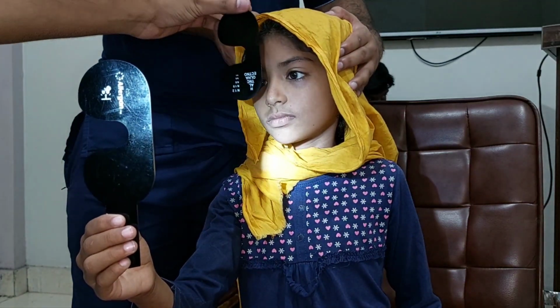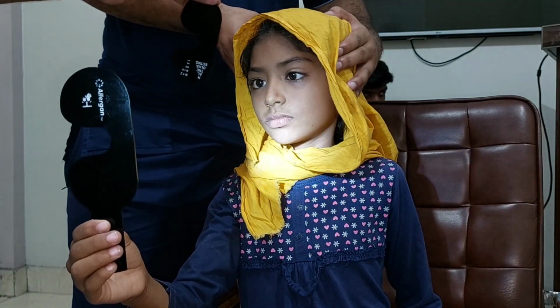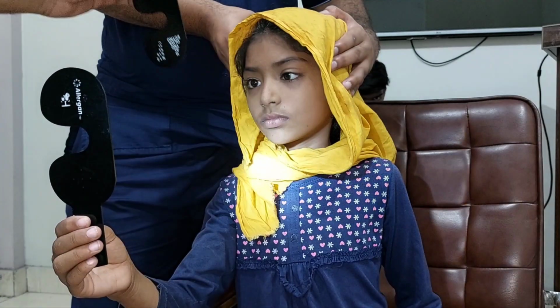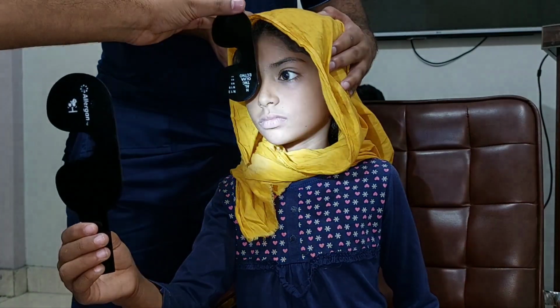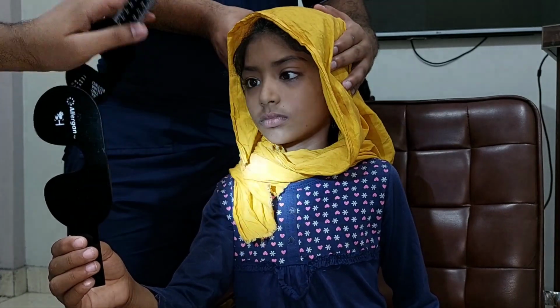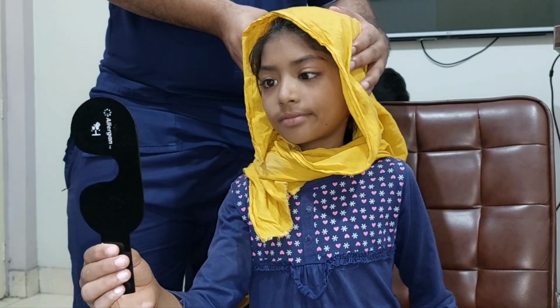On uncovering, the left eye does not take any fixation, does not deviate. But the right eye, on uncovering, takes from upward direction to central fixation.